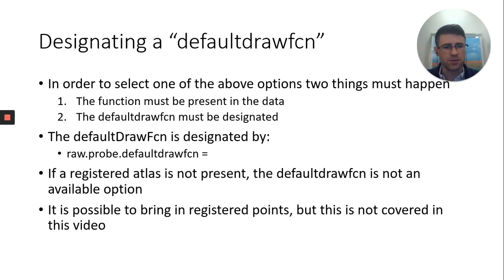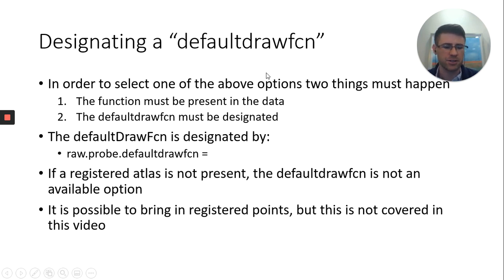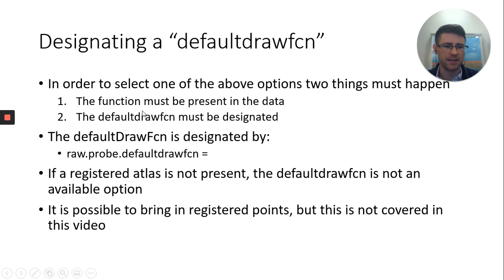And specifically, in order to call these, you're going to use the default draw function. The default draw function is a property of the raw.probe variable. And you can see it right here. So in order to call it, you'd say raw, raw being your data you loaded in, .probe.defaultDrawFunction equals. Then you'd actually state one of these in a string format. So if a registered atlas is not present, you actually won't be able to call the default draw function. And the easy way to do that is you can say raw.probe.